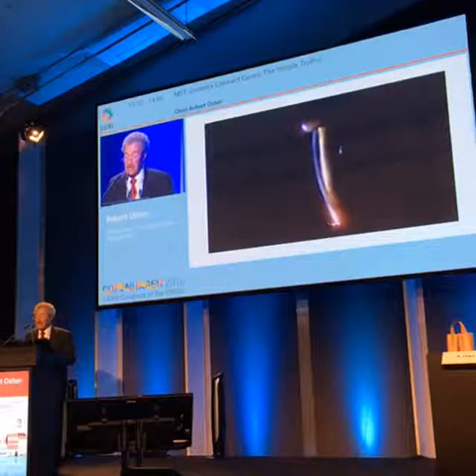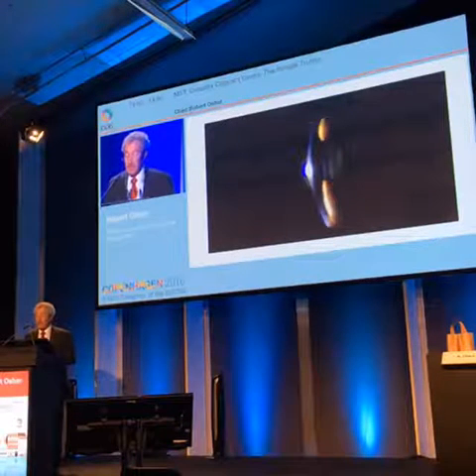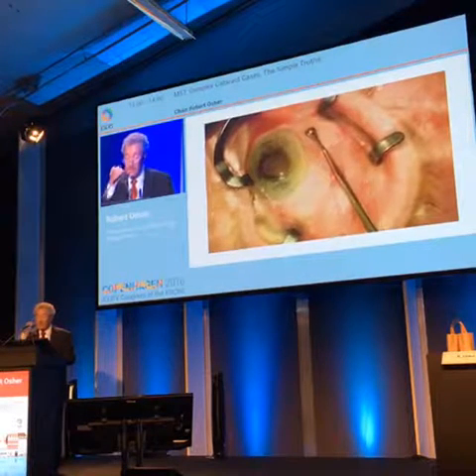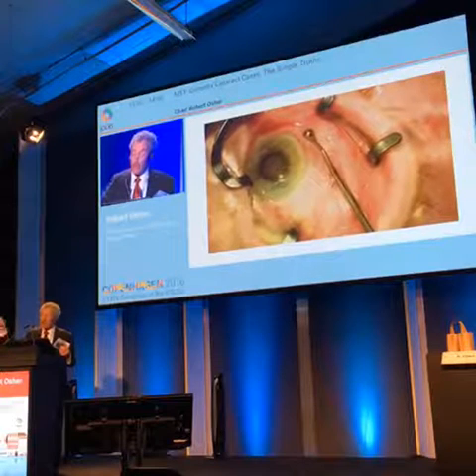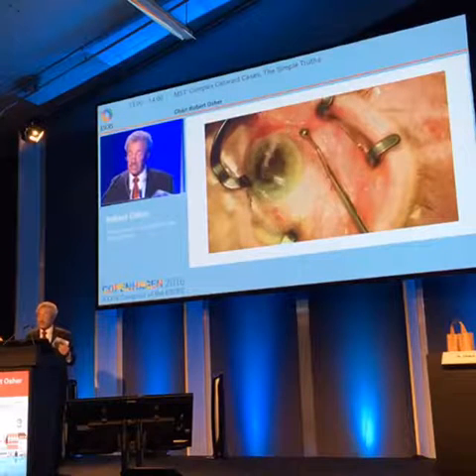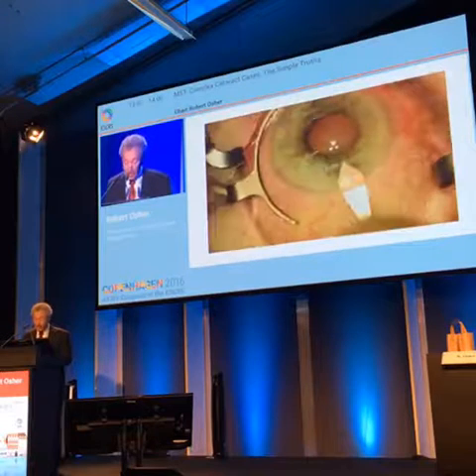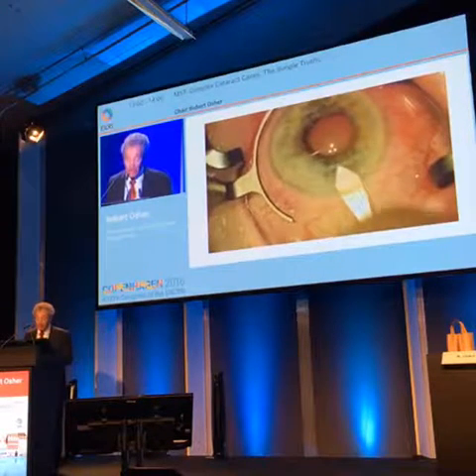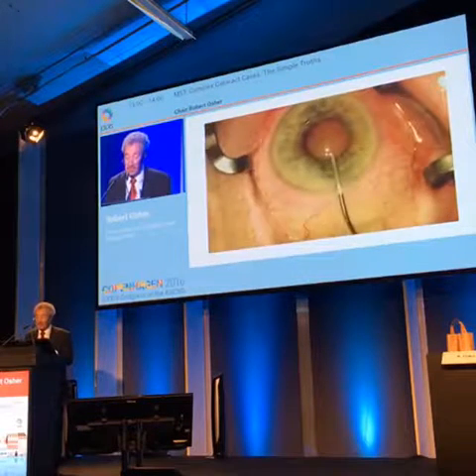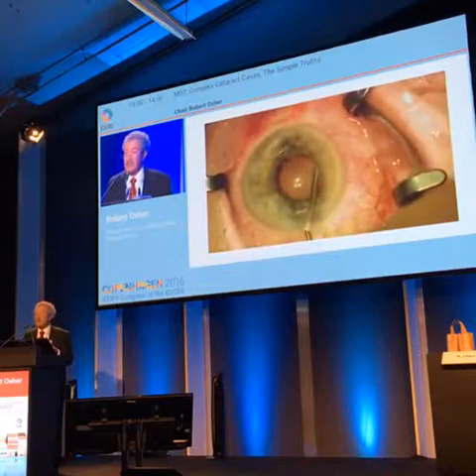This is a lady who has mild Alzheimer's disease, a very small pupil. Her Alzheimer's disease is about the same as mine. She has nanophthalmos, so I always compress the globe in nanophthalmos to dehydrate the vitreous. It's very important to do that. She's had peripheral iridotomies for angle closure, and she has an anterior chamber depth of 1.5 millimeters. It is said that you can't put a Malyugin ring in, but that's not true.